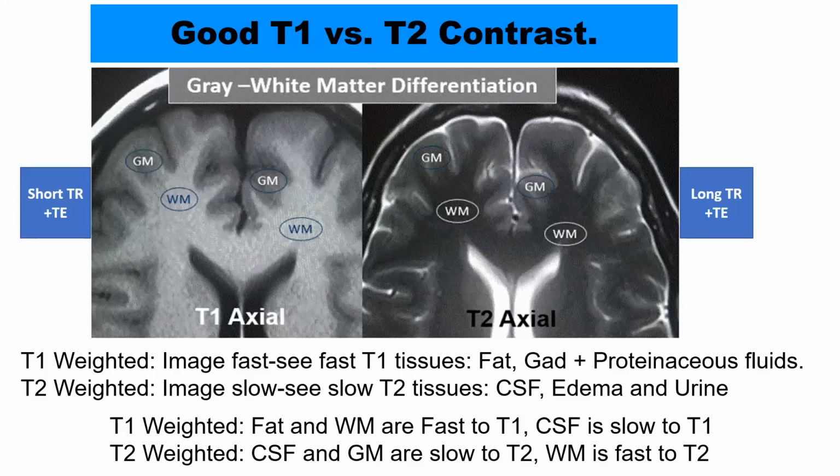So when I say good T1s, with good gray-white matter differentiation, over on the left-hand side it's T1: fluids are dark. That's why gray matter is dark. It's got a high water content. It's T1 weighted. Myelin in the white matter acts kind of like fat. It's got a short T1, so it's nice and bright. So that left-hand image is beautiful T1 weighted contrast.